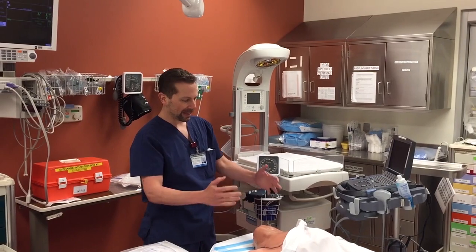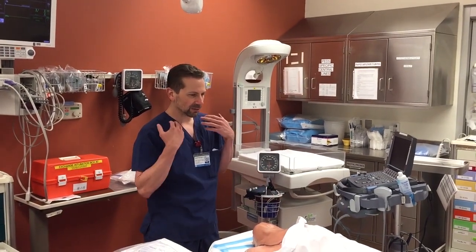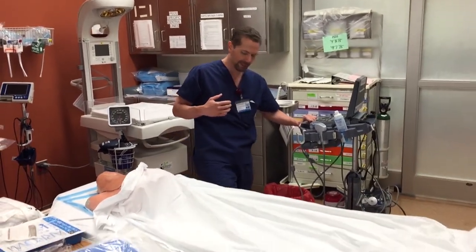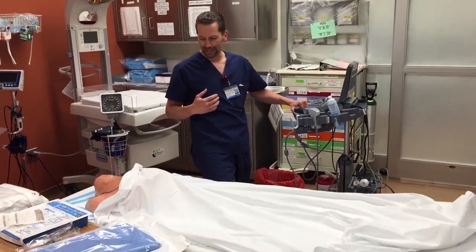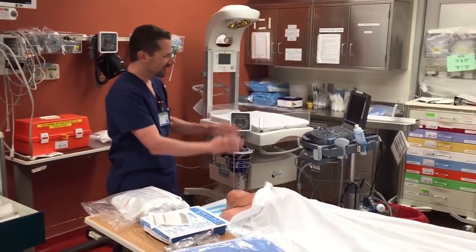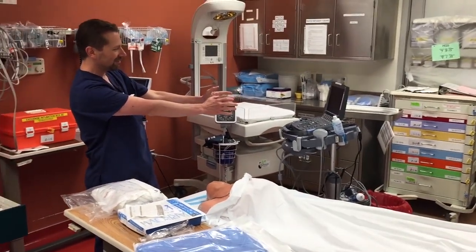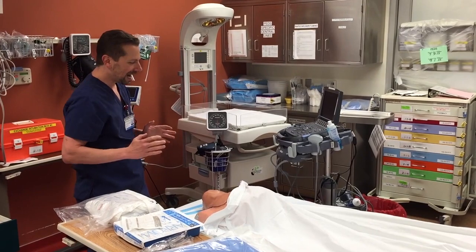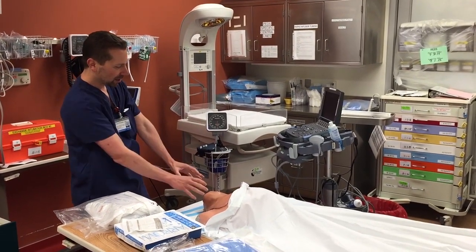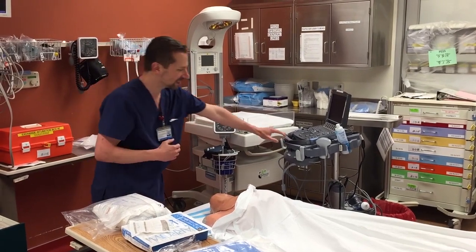The first thing is you want your patient in Trendelenburg if you're going to be doing a line in the neck, because that's going to keep an air embolism from happening. If you're going on the right side of the patient, the ultrasound machine gets positioned on the left and vice versa. It's always opposite your side, because that way your line of sight can encompass both the spot you're sticking as well as the ultrasound screen.